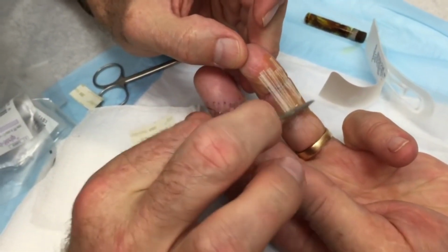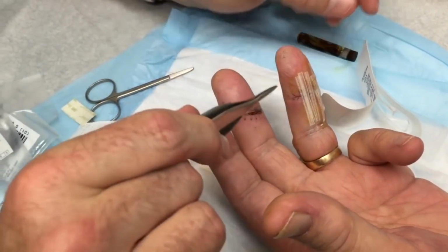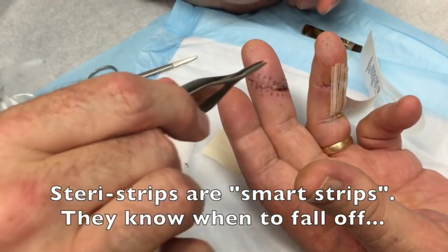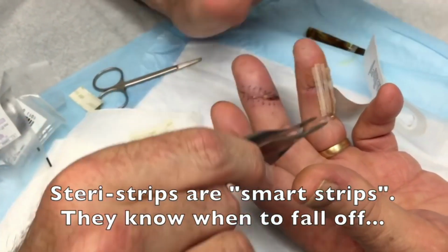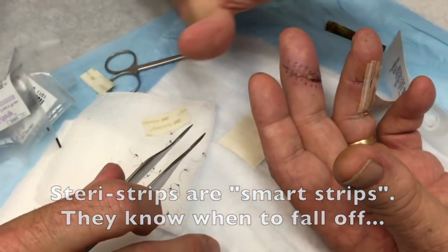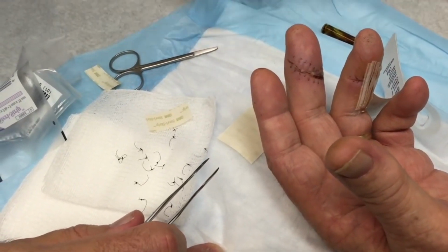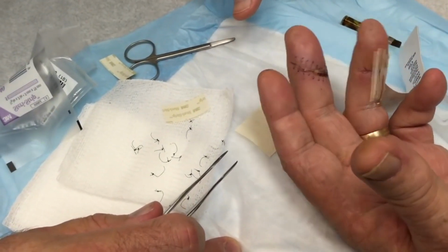Now we're going to put a little dressing over this, and I want you just to leave it alone for a few days. These strips themselves, you do not have to remove. These will fall off on their own, okay? No more antibiotic ointments. Keep it clean and dry is all I'm asking. And if you want to take the dressing off while you take a shower, that's fine. Just don't scrub on the hand or anything like that, okay?